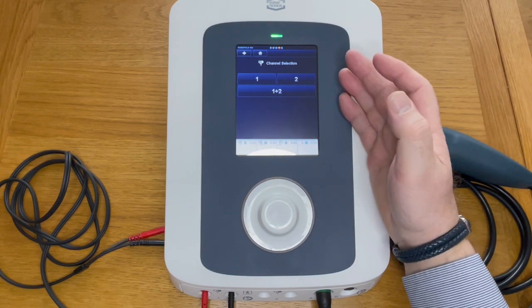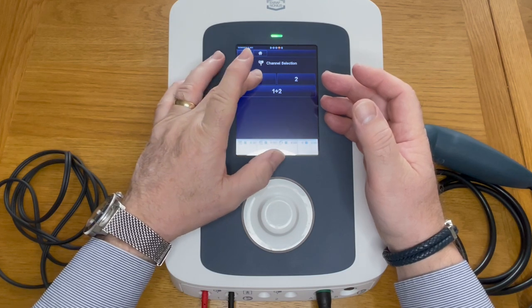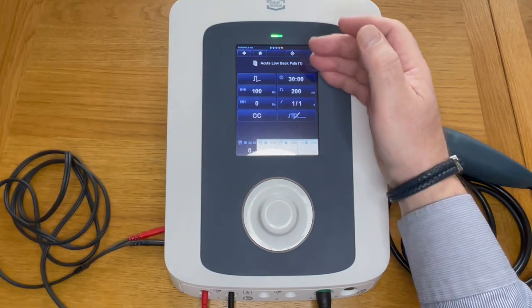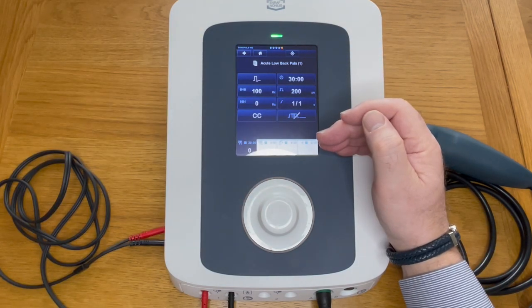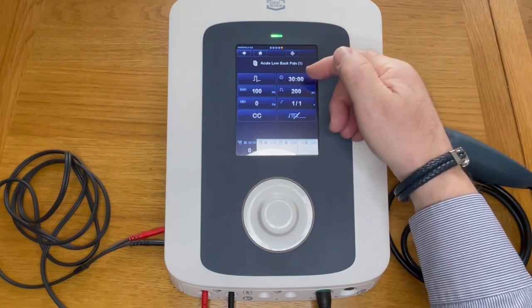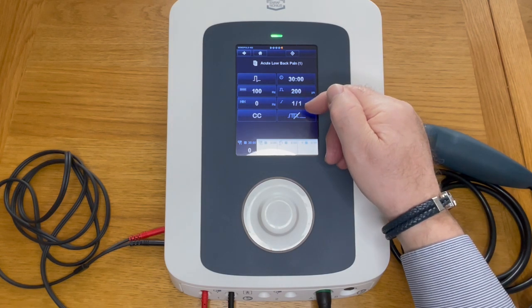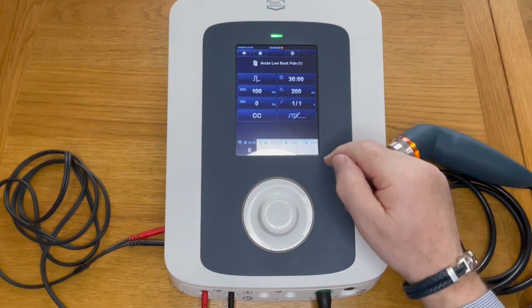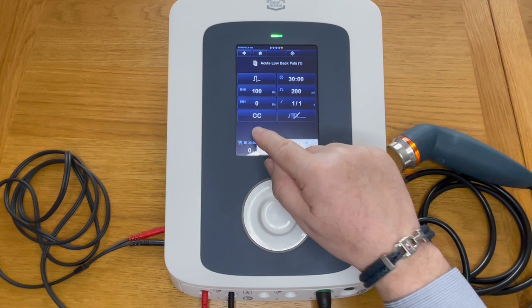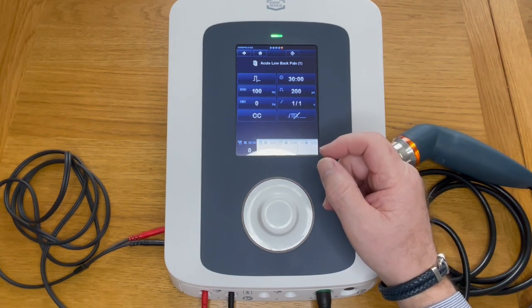That brings you into the channel selection — you can have channel one, channel two, or both, depending on what you want to treat. If we select one, it will tell you exactly what the protocol is: your waveform, pulse rates, timer, pulse width, and rise and fall time of the pulses.